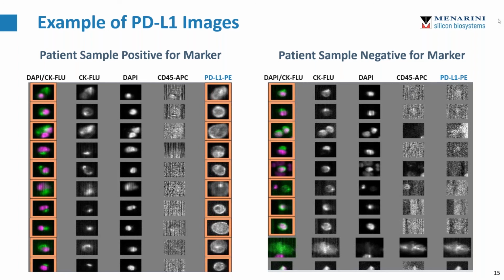So the same can be shown. That was my idea, to show you some other markers, ER and HER2, I believe. I still cannot make this work. So the images that were part of my presentation are very similar to what you are seeing here.